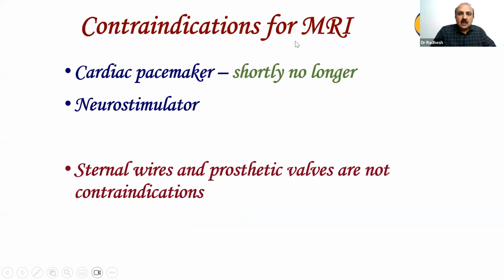Now, what are the contraindications for MR? Before you send the patient for MR, you have to ensure these patients do not have a pacemaker.